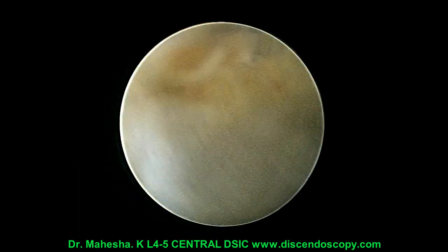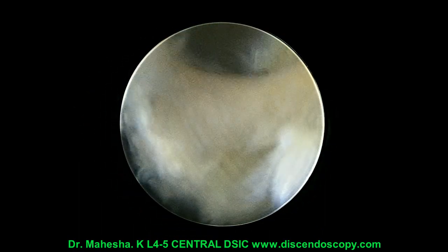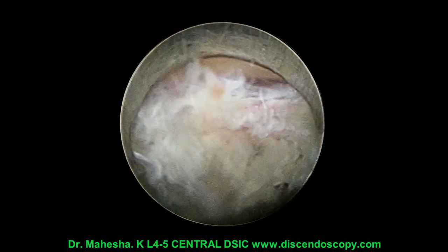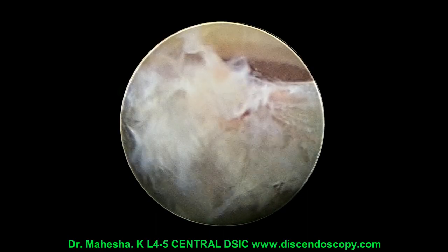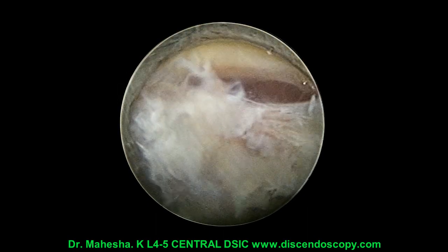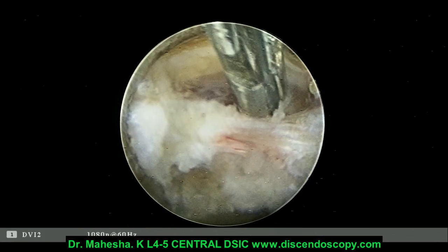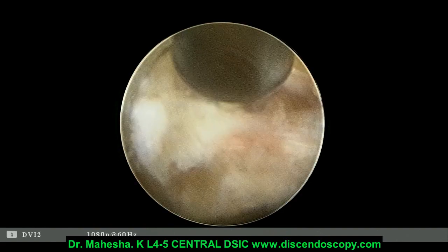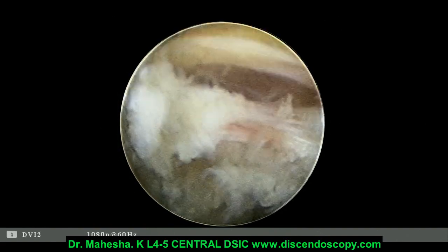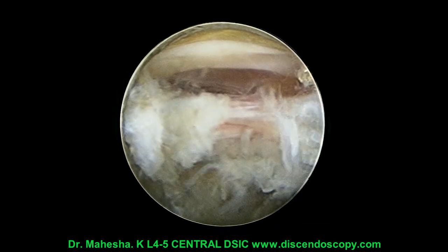You can see that the extruded fragment has been caught and it is being removed. Now we pull out the cannula to expose the edge of the annulus. You can see that there is epidural space at the top, redundant annulus in the center, and the disc space at the bottom. RF cautery is used to control the bleeding.